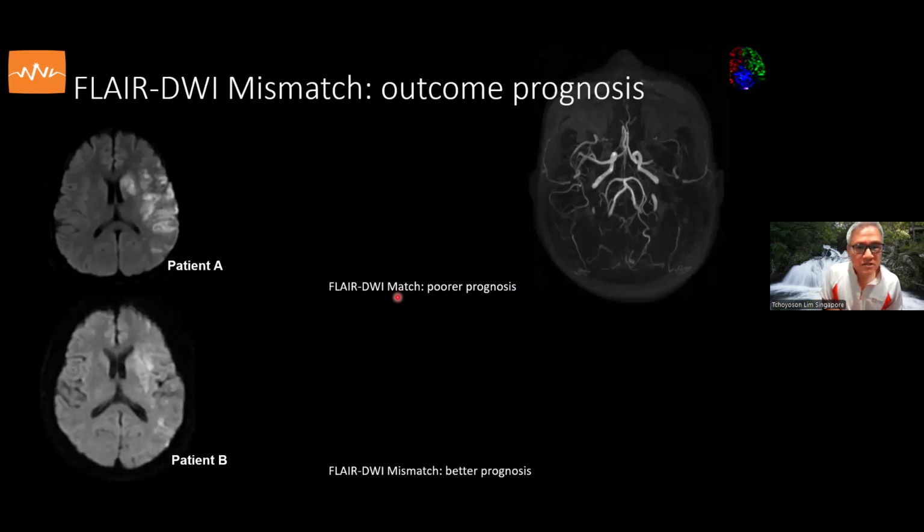This brings us to the MR method in the acute thrombectomy situation.